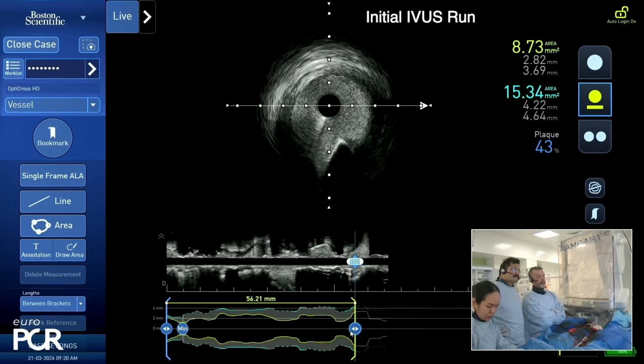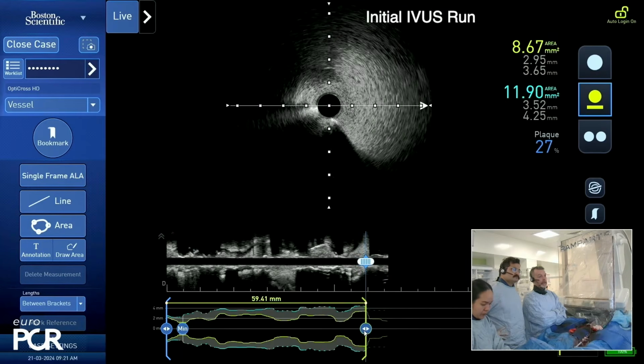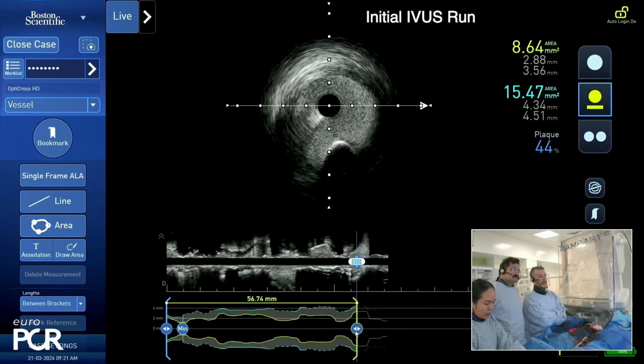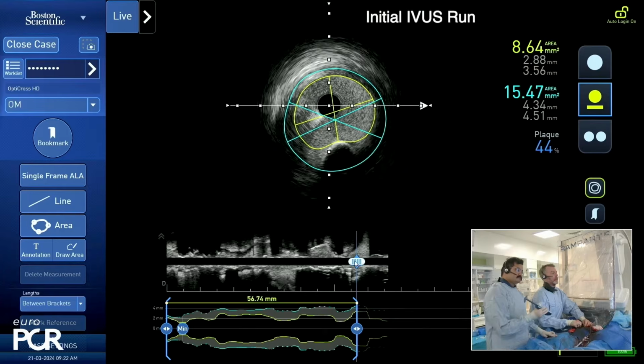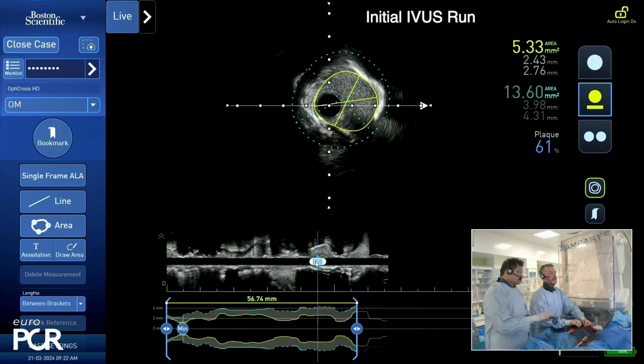I think you want to take it back a bit further than that, even, don't you? That's the aorta. Okay, fine. All right, very good. So then, just click, it's that little symbol. There you go. Yeah. Okay. It's 4.5. So there. I think kind of there we want to.